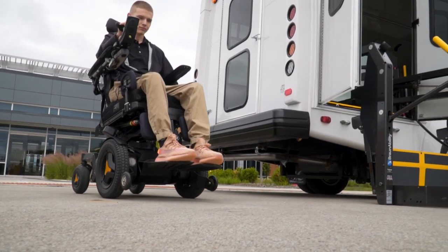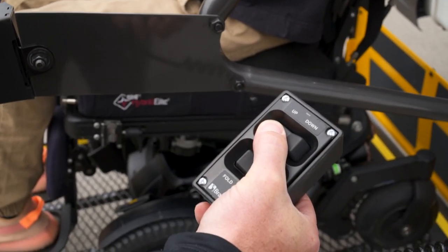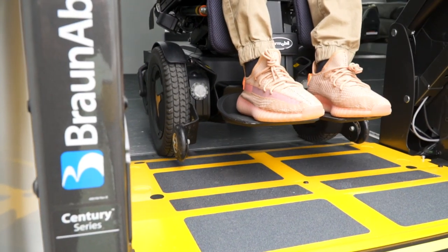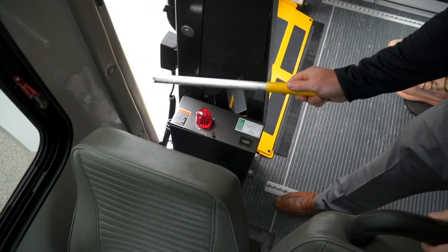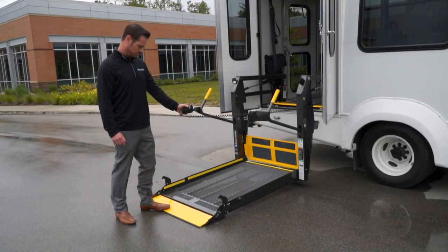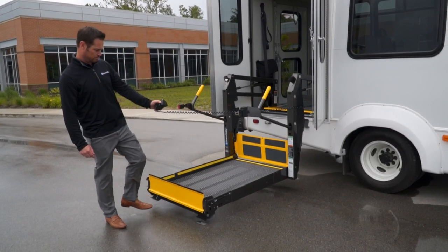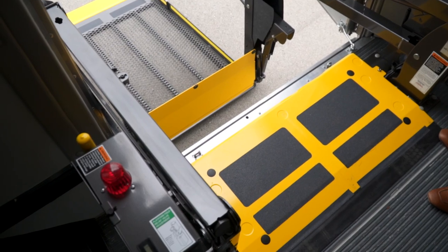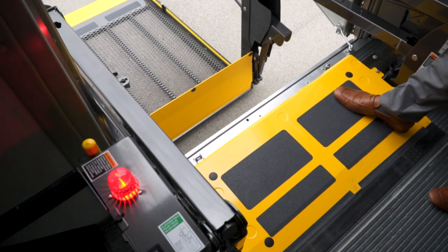BraunAbility makes it easy for a trained attendant to load and unload passengers and mobility equipment by providing fully automatic operation of the lift and easy-to-use manual features that can be used even in the unlikely event of vehicle electrical system failure. Before attempting to operate your lift, it's important to know that BraunAbility has several built-in safety features working for you, designed to help prevent conditions that could result in accidents or injury to passengers or operators.